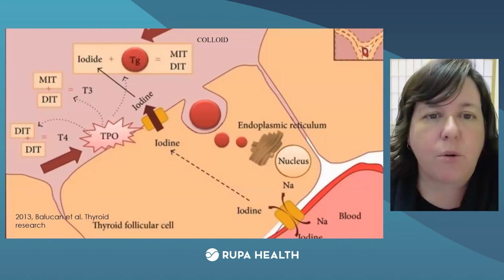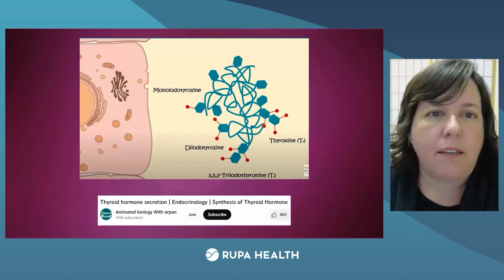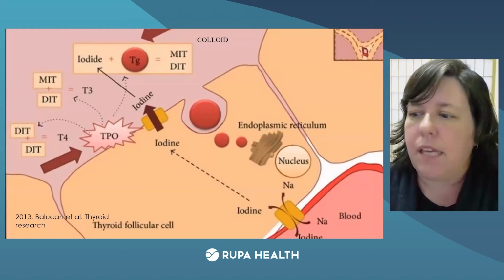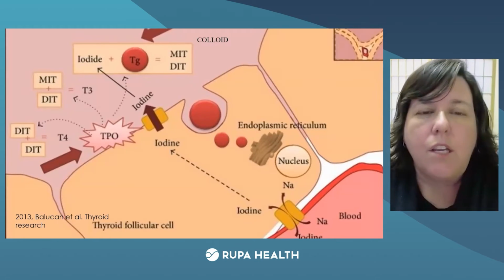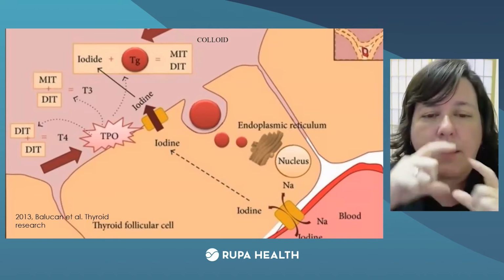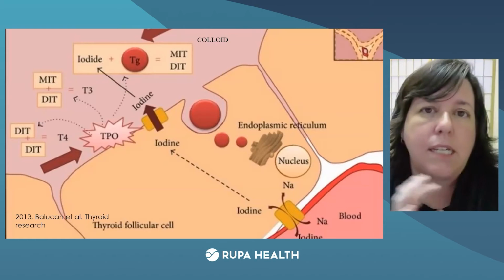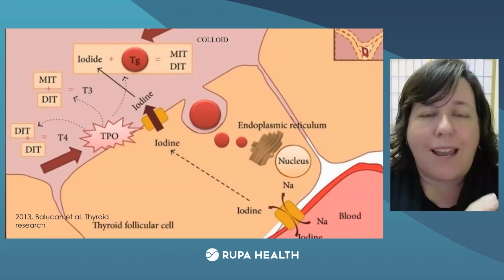So I just wanted to give you a couple of other markers with it. And just one is to show a picture. Sorry, let me just click here and make sure we got this on here. Whoops, gonna go back. So at the bottom of this slide, what you're seeing is the blood. And at the top of the slide here, you should see where the colloid is. So that's like the center of the follicles. And then there are these columnar cells all the way around that are part of the wheeling and dealing between TSH, getting things into the thyroid, making thyroid hormone and storing.